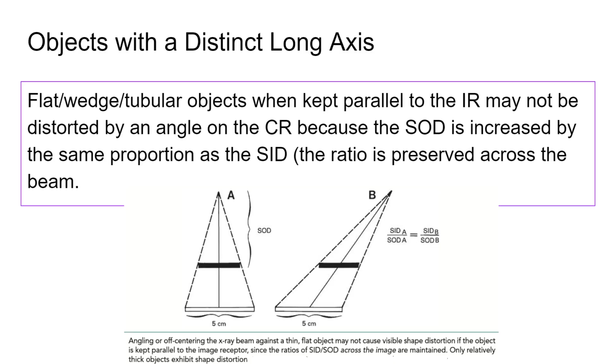You would expect there to be elongation here because you have an angle. Right? It doesn't matter what the angle is, but you have an angle, so you would expect elongation. But because it's nice and flat, we don't see a lot of distortion, right? In fact, based on these numbers alone, we don't see any distortion, right?